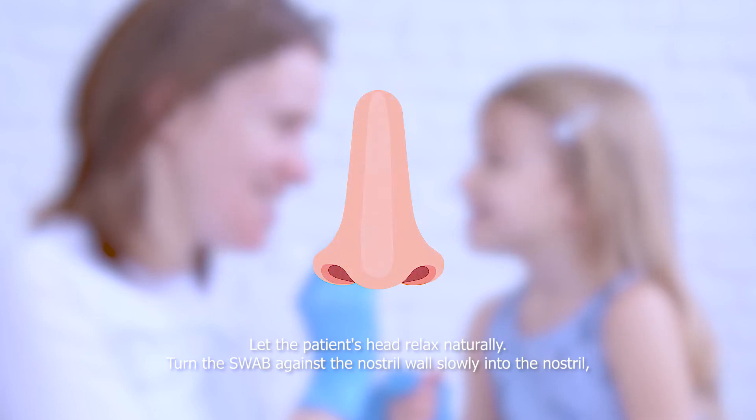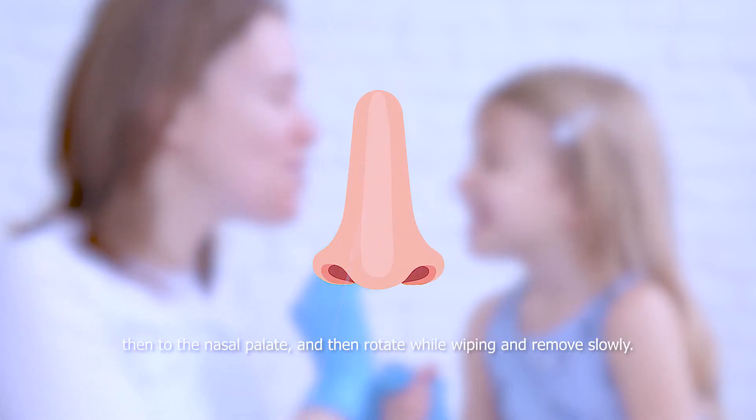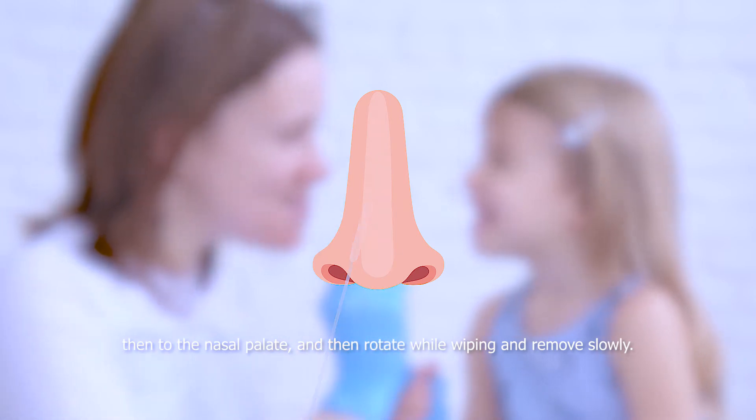Option 2. Let the patient's head relax naturally. Turn the swab against the nostril wall slowly into the nostril, then to the nasal palate and then rotate while wiping and remove slowly.